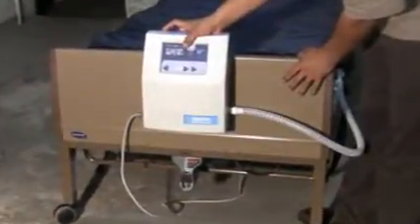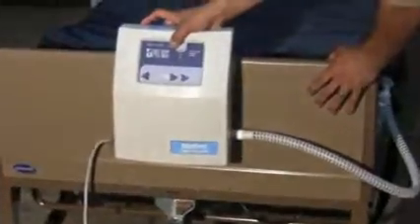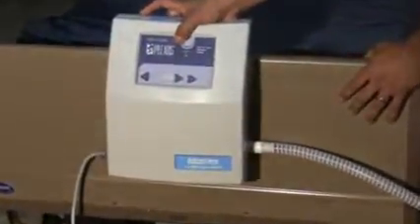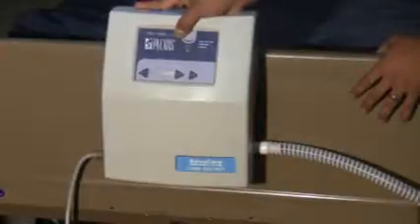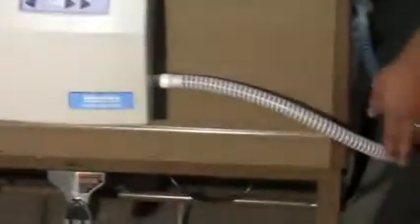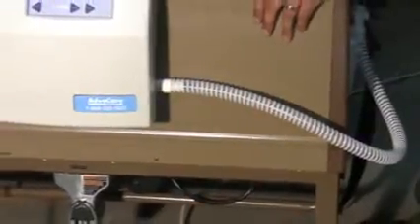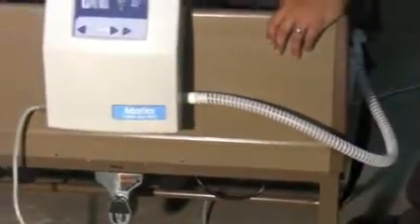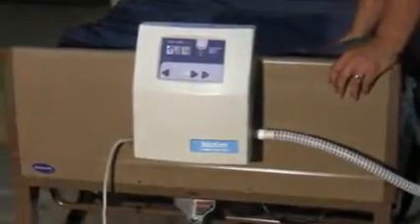to the air unit. If the air filter of your air control unit is not checked frequently and it does become blocked and clogged with dirt, it may cause your air unit to overheat, which will tend to blow hot air into your air tube in order to inflate your low air loss overlay. Overheating of the unit may cause the air overlay to seem hot to the touch.